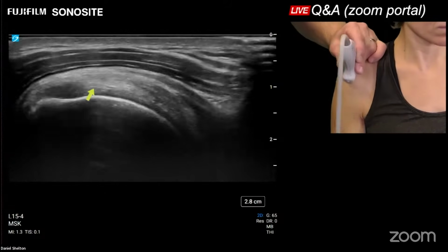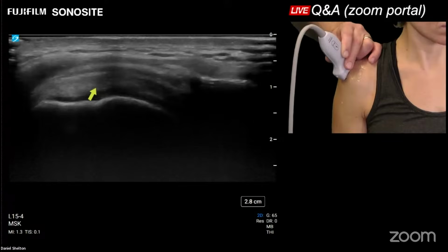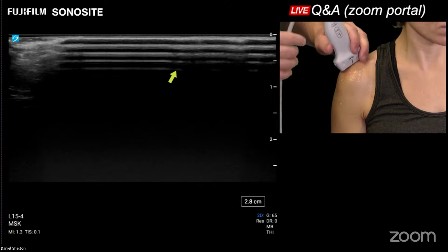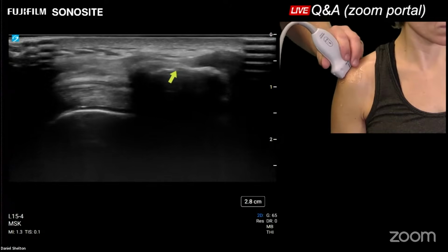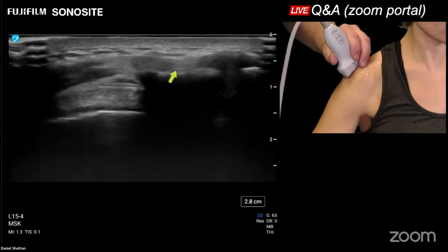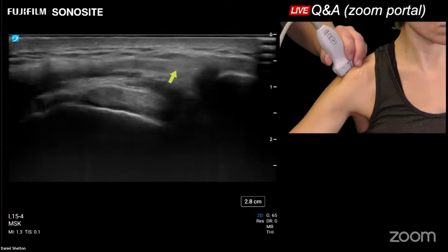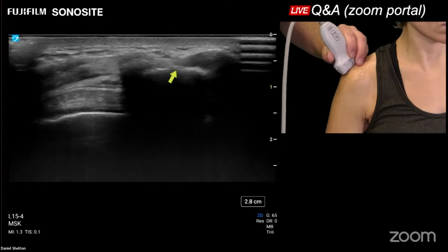We got good volume through the supraspinatus and long axis. And then I take the proximal corner of that transducer up here by the acromion and just put all the weight of your transducer right there on top of the acromion like we talked about. And then we're going to lay the rest of the transducer right over the cuff structure and have our patient chicken wing out or abduct a little bit slowly. Sometimes passively too is better, but the reason we put our weight right on that acromion is so the deltoid doesn't bump your transducer. It's really, really nice and smooth, and you don't compress any bursitis.